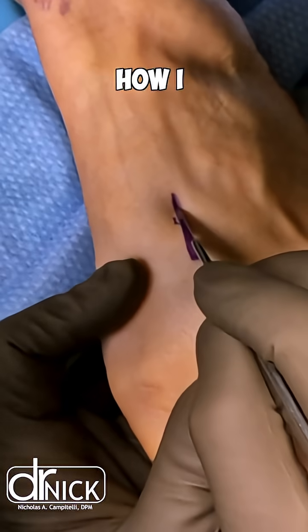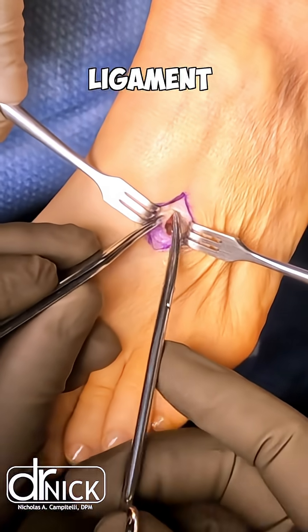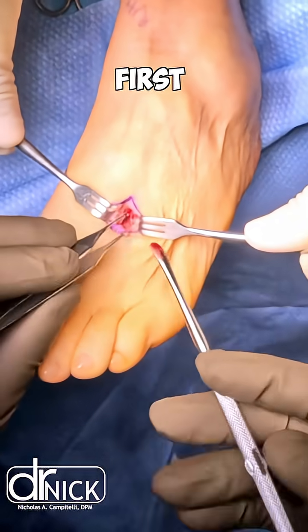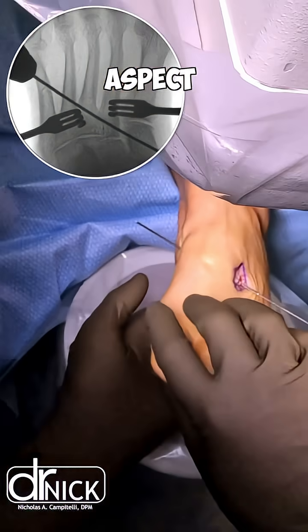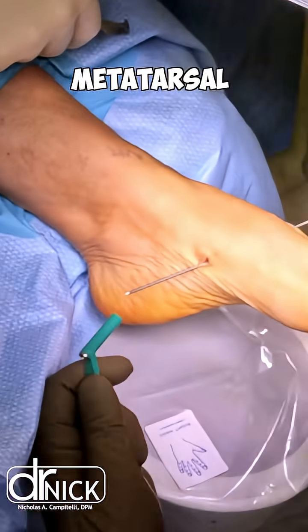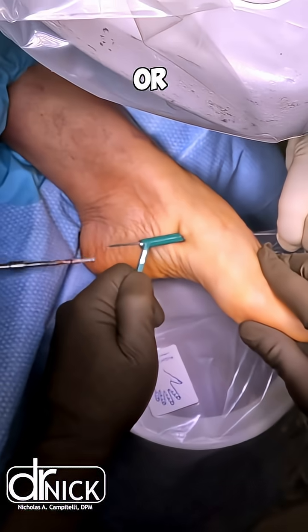In this video, I'm demonstrating how I repaired a Lisfranc ligament disruption with the Arthrex Ligament Repair Kit. You can see we're augmenting the rupture by first dissecting down to the lateral aspect of the second metatarsal. We put a drill hole through the second metatarsal across the medial cuneiform and recreate or augment the Lisfranc ligament.